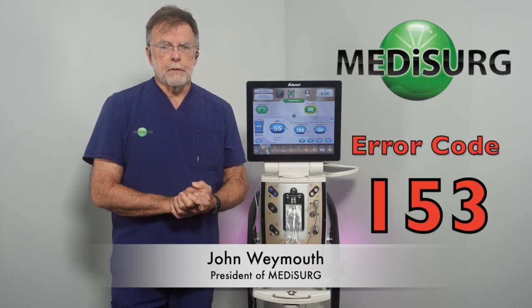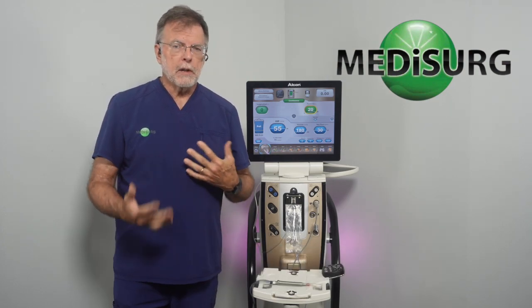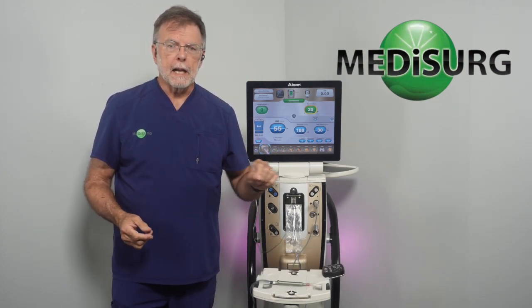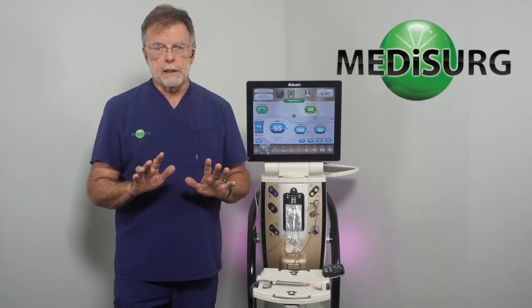Today's error code is app 153, called Bag Bay Door Open. Typically, this happens during surgery where somebody accidentally opens the door, and as long as they close it, it's not a problem. So let's demonstrate that.